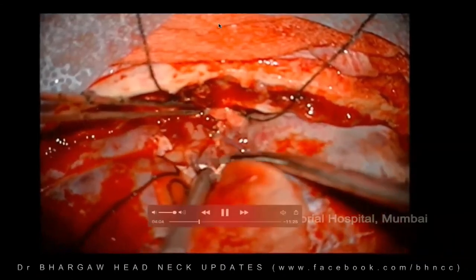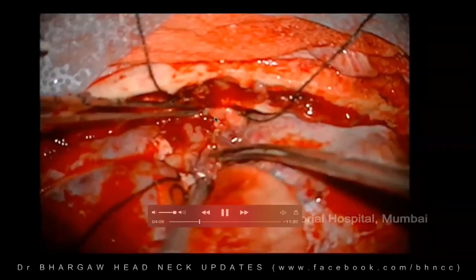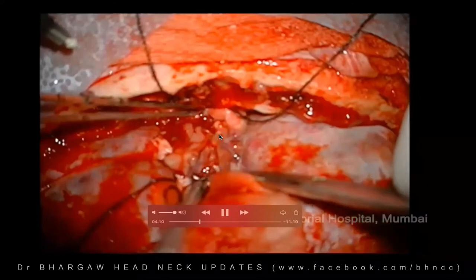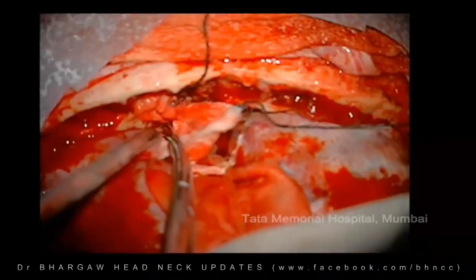So there's no disease there. That's the normal parenchyma that is seen. That's not the disease. So we're just making sure there's no disease, and we're removing some part of the frontal lobe. We know that we can remove some part of the frontal lobe without causing much neurological deficit.